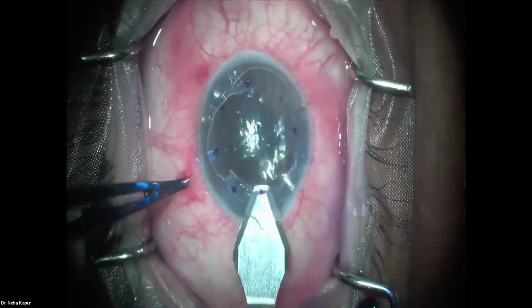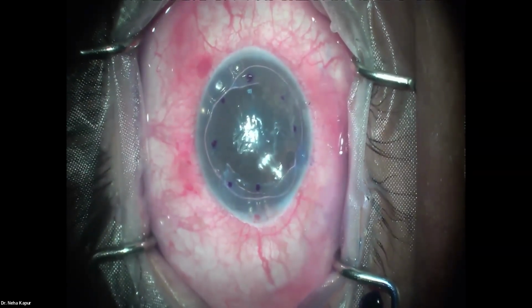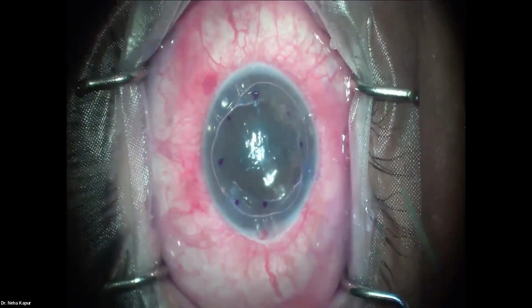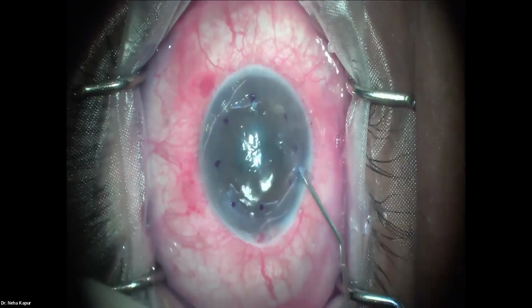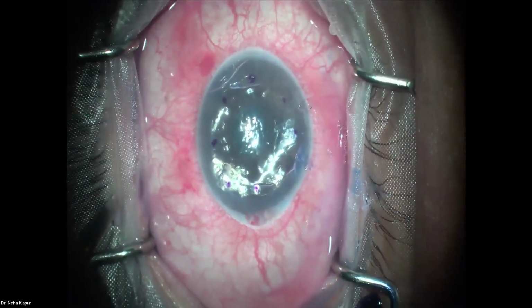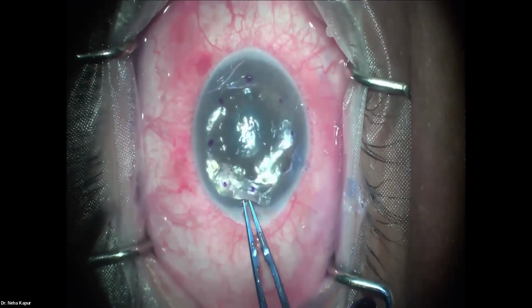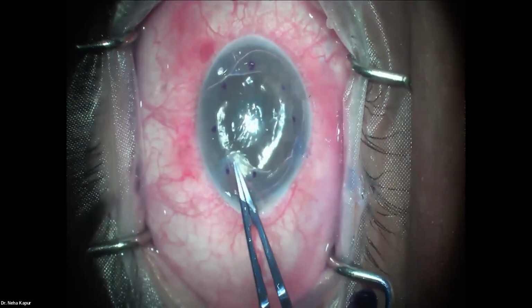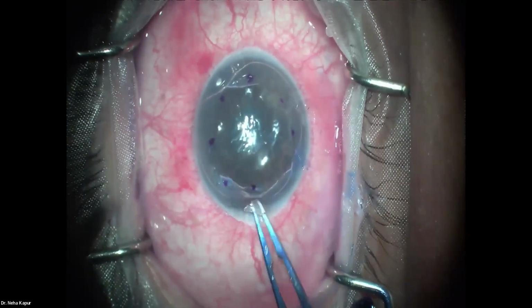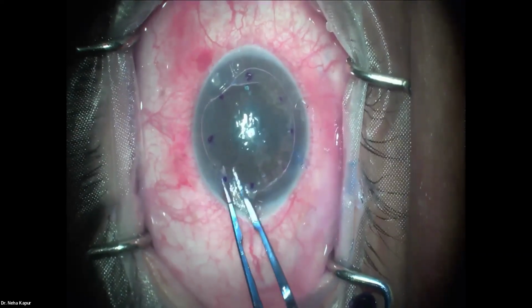So we made an entry after the 2.8 with a 5.2 mm blade. We'll put in the Sheets glide in position. McPherson. There's a little DM here at the edge, which was visible. It's good to get that out if it's coming in the area where you are to transplant the tissue, where your lenticule will sit.